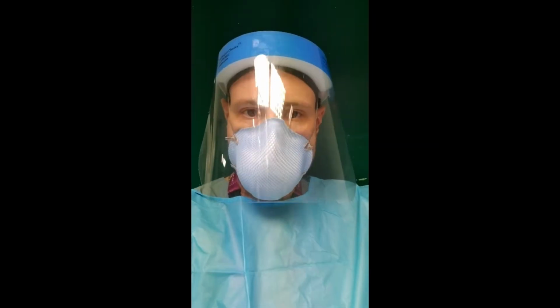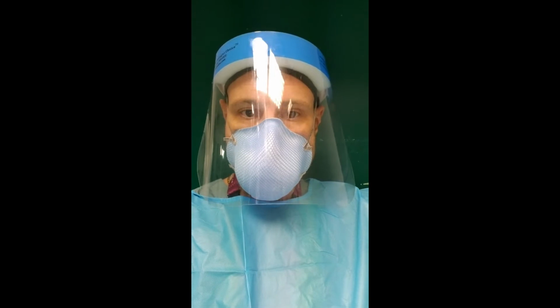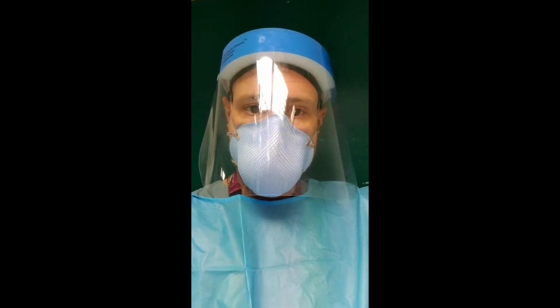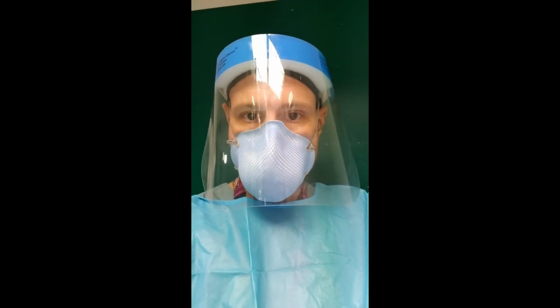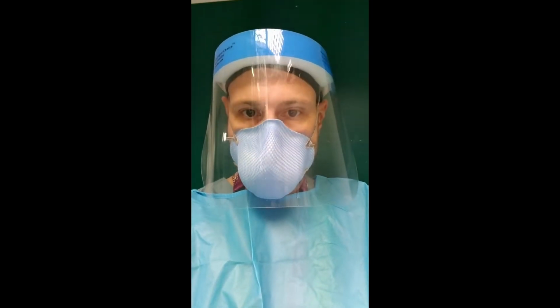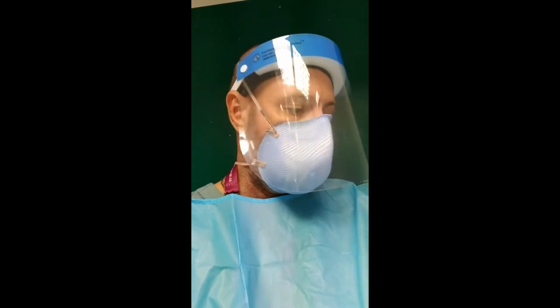We're increasing the P high incrementally, taking our time, using the end expiratory lung volumes, seeing if we're recruiting, trying to send the gas more to the dorsal area and remove a little bit from the ventral area. That's probably occurring just because of the prone position. There's more pressure on the chest. We've got the weight now bearing down on the chest. So that's why we're seeing that orange on the ventral area, and we're seeing blue starting there, okay?